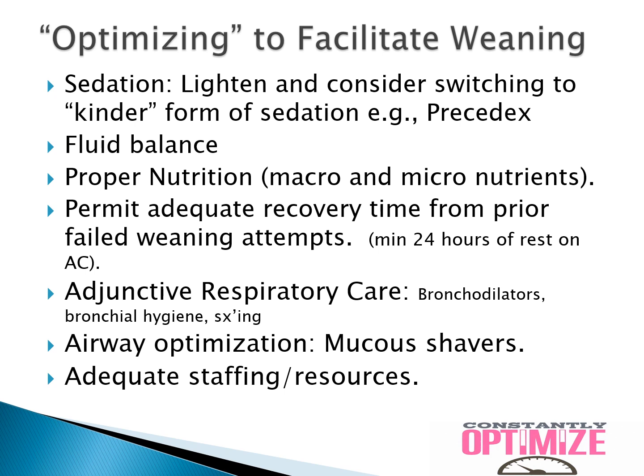And there is a relationship between how good your staffing is and what your ratio of respiratory therapist to ventilator is. And yes, you can stretch. I can handle 7 ventilators, but I can tell you right now, when you start giving me 10 ventilators, I can handle it, but they're not going to get weaned. There's stuff that's not going to get done as well. It may get done, and weaning is certainly one of those things. But just to state the obvious, adequate staffing and resources is critically important.